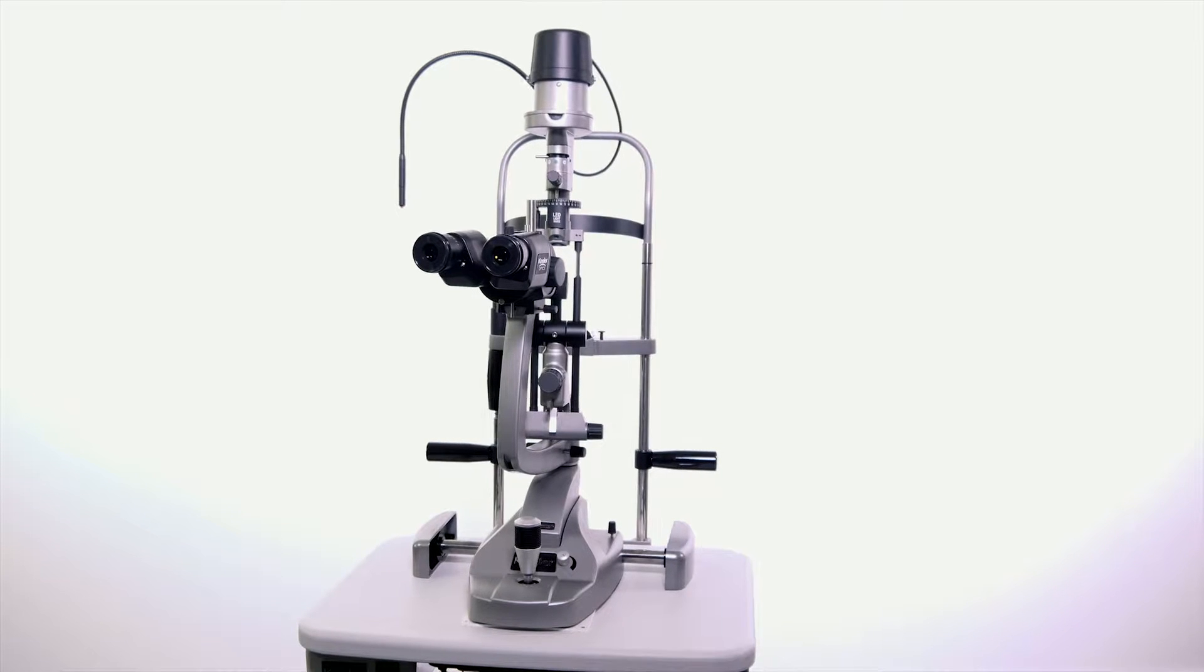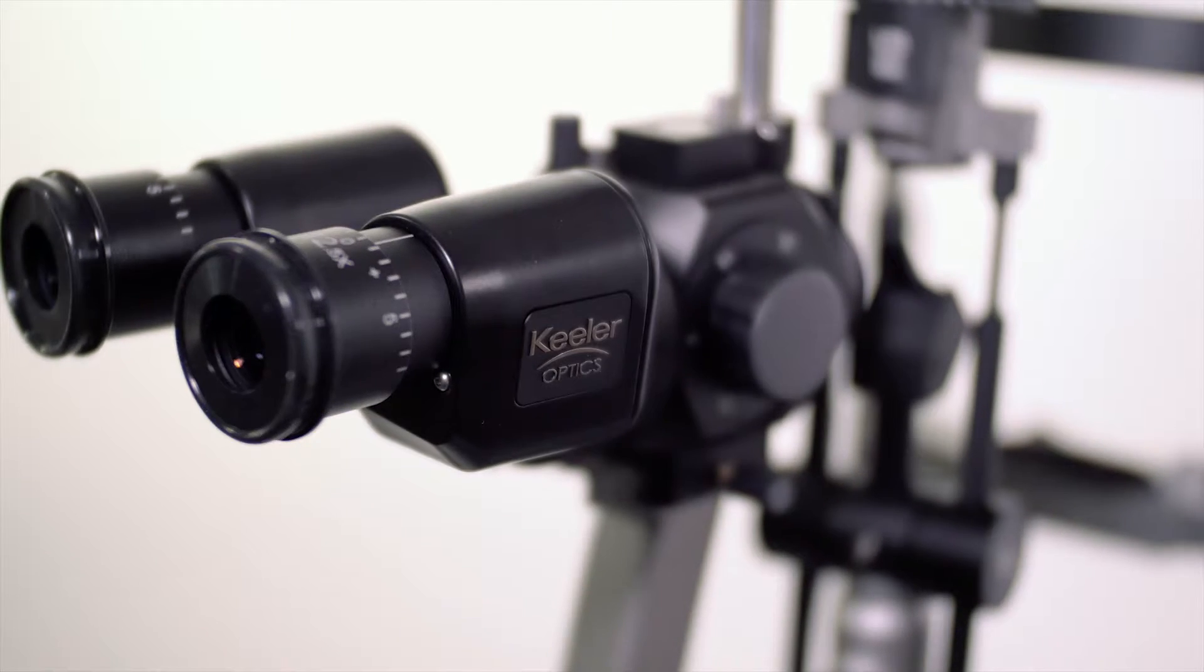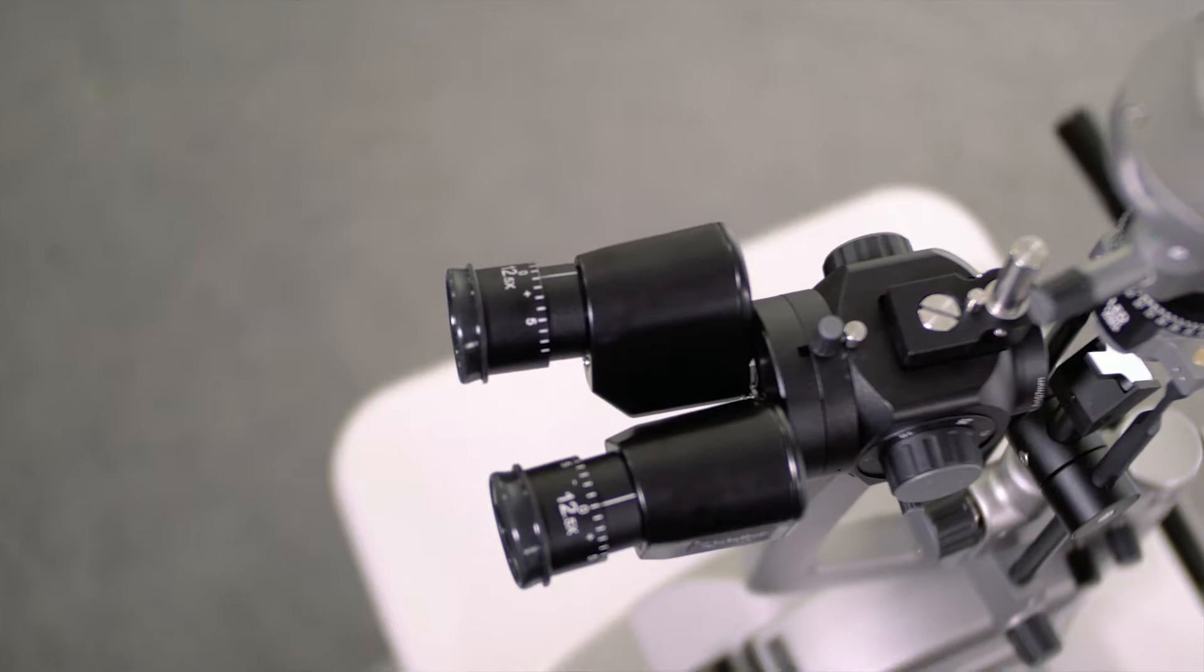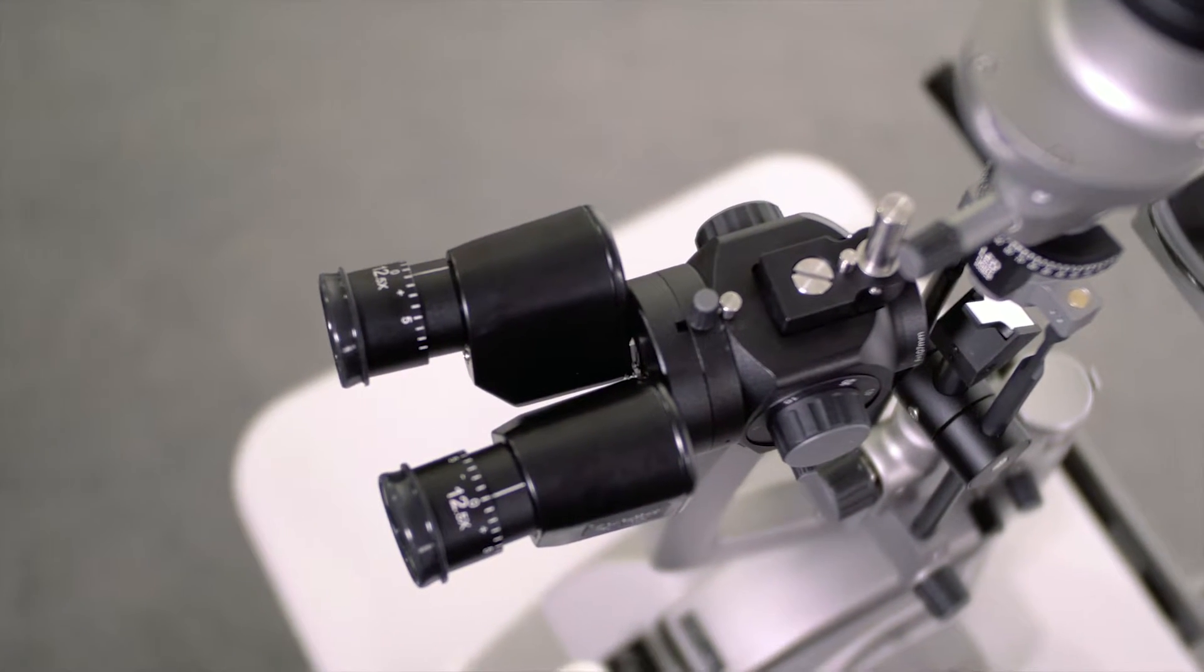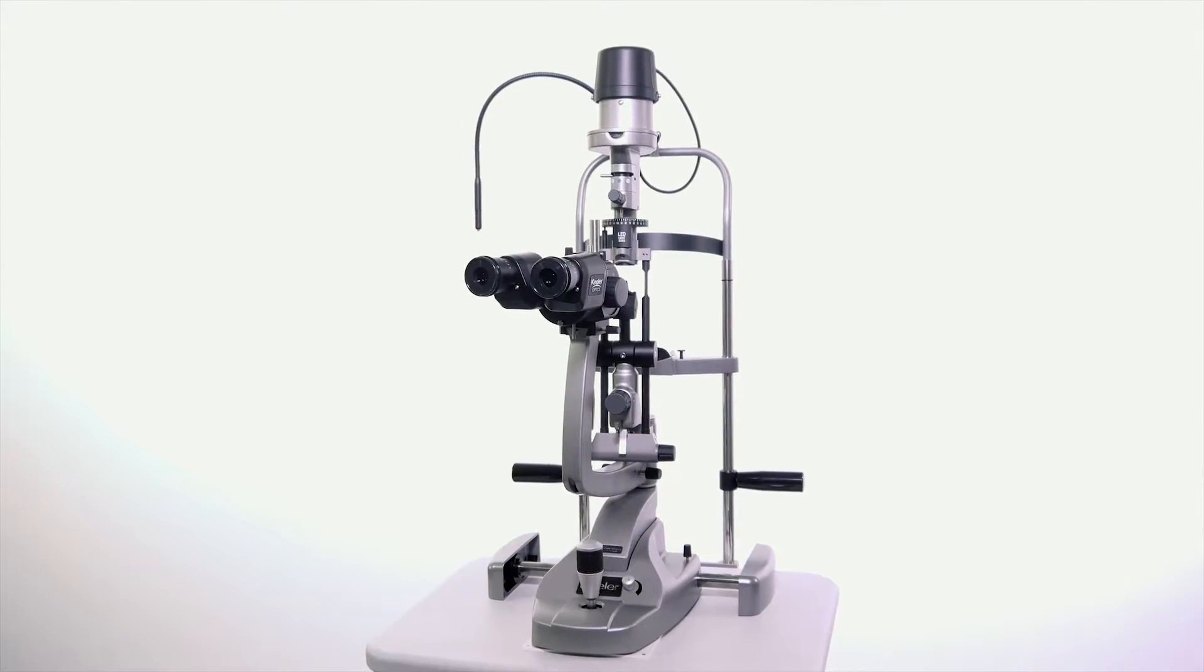The K-Series slit lamps are our upper illumination systems that are used for examination of the anterior segment and posterior segment of the eye. This video will provide an overview of the features of the K-Series and instructions on how to use it.